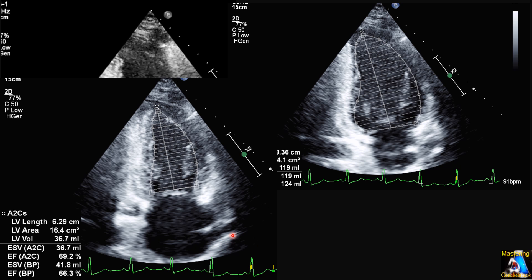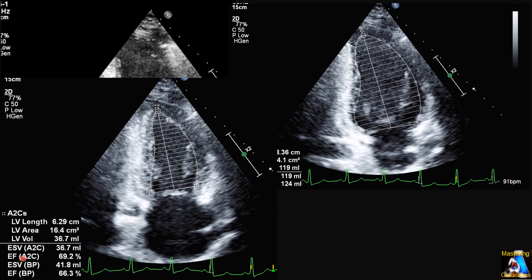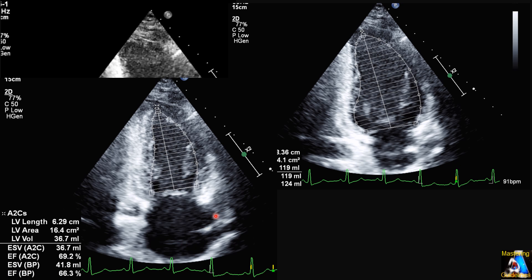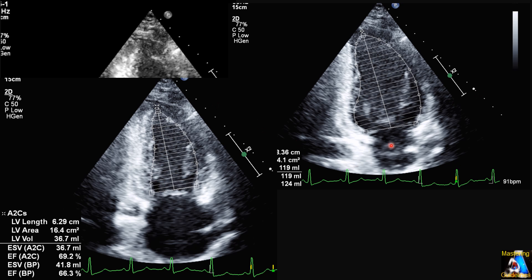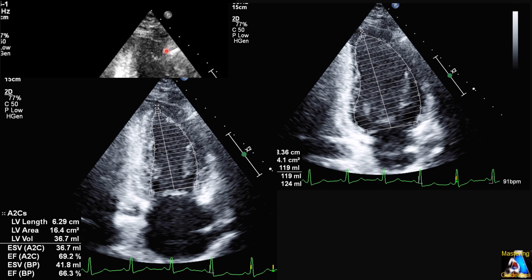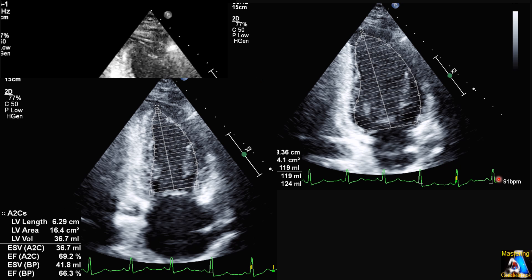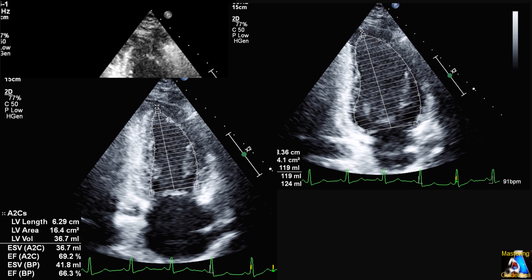How do we fix it? Second, based on the results shown — the same view gives 69% and biplane gives 66% EF — based on 2D eyeball guessing, does that match your measurement? Does this measurement match the cardiac activity on imaging, assuming there is no wall motion abnormality and no electrical conductivity disorder?